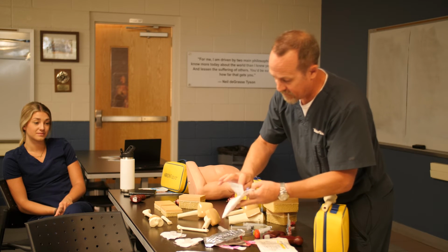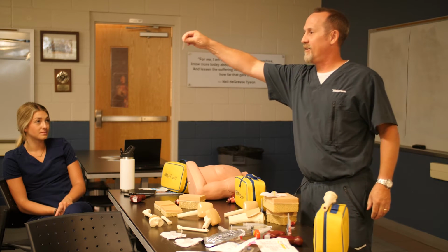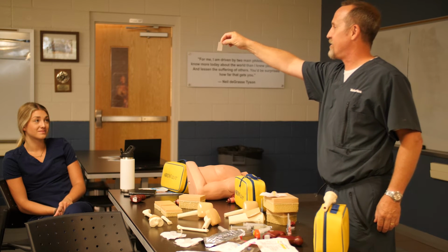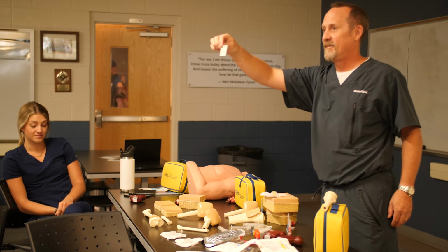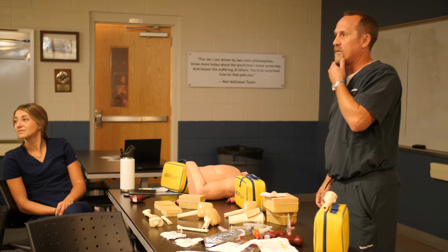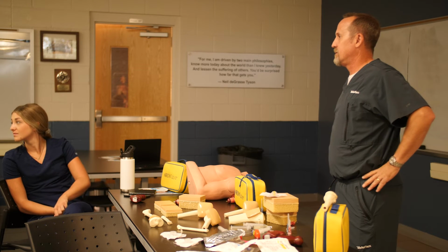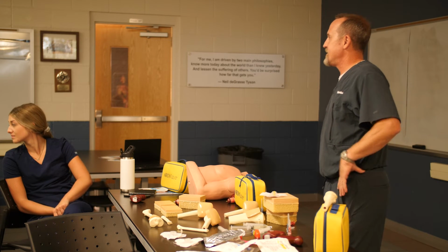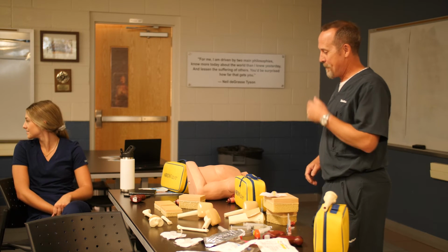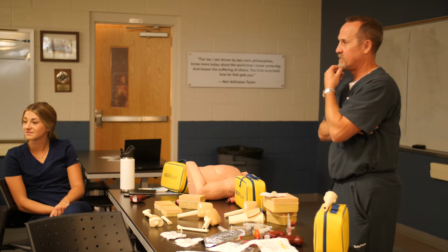It's funny you say that, because every one of these kits, when you open them, you'll see a little package, a little insert that comes out. It's got a picture of a sternum with a big slash across it. Okay? I was showing them this, we have this fast interosseous infusion system. This is the one that you're talking about. I don't know why, people do random stuff. It's been in there since 1982 or something. We're just gathering stuff, you know.